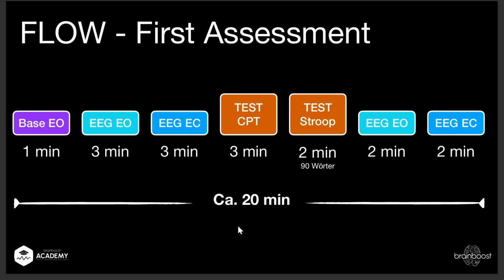Of course, if you have a person who is moving a lot, or you want an intense interpretation of different data while the client sits in a chair for 45 minutes, this can all be different. But I think this is a very good compromise so the client doesn't have to spend too much time sitting in a chair, getting tired or angry or frustrated.